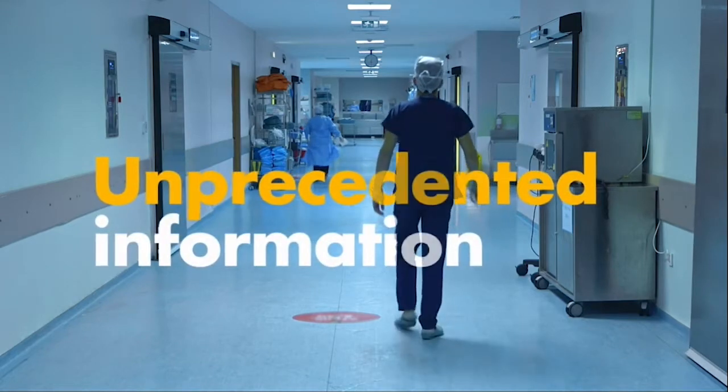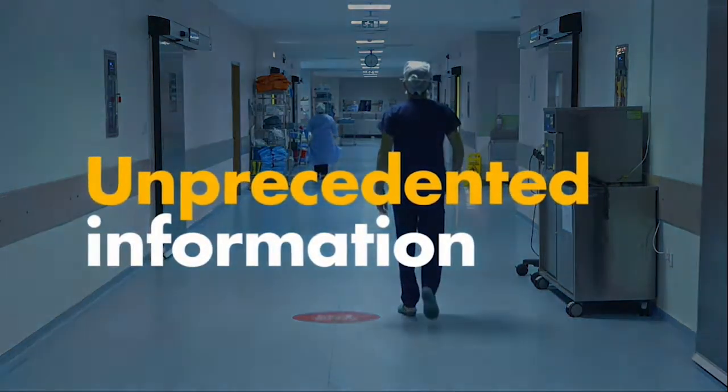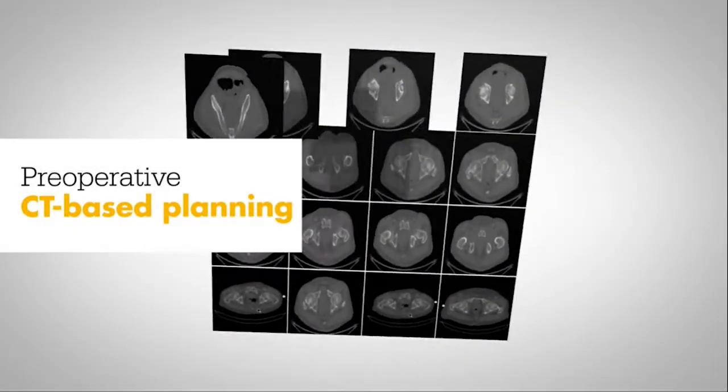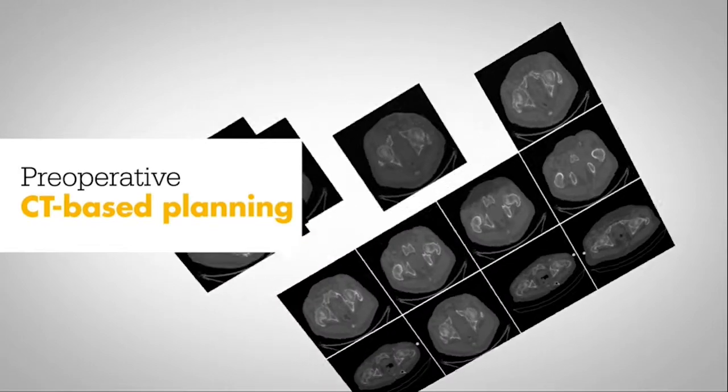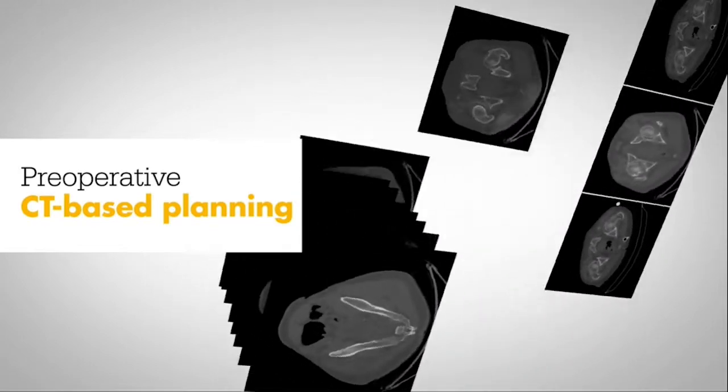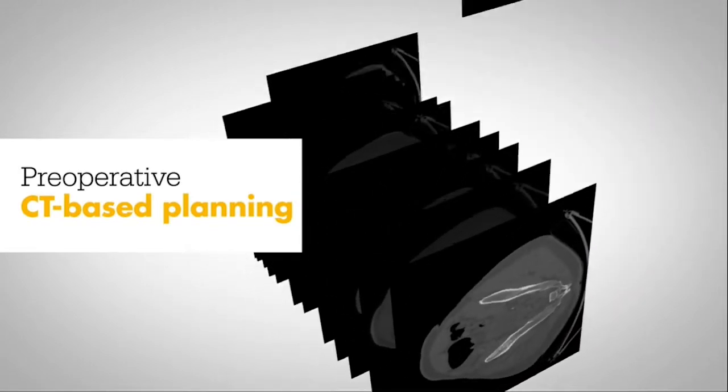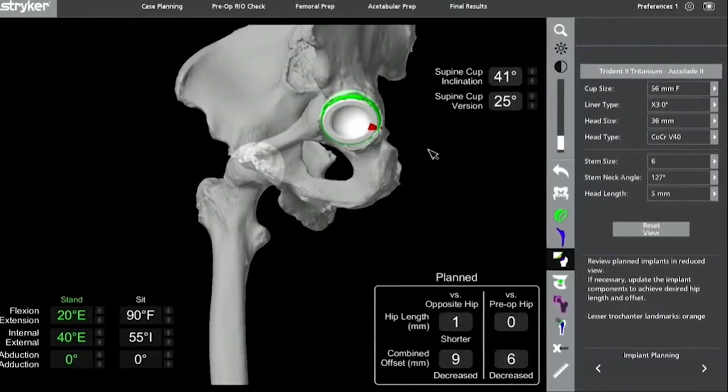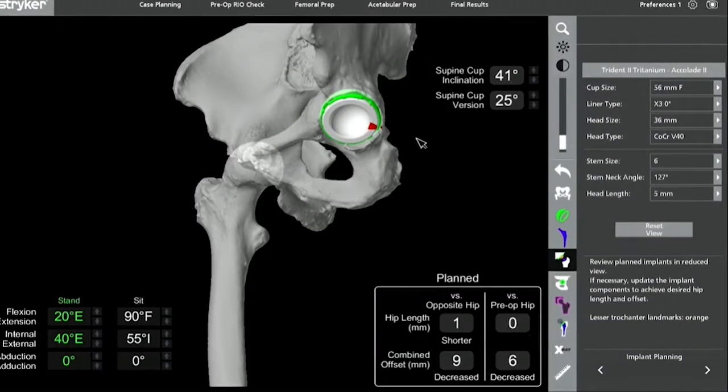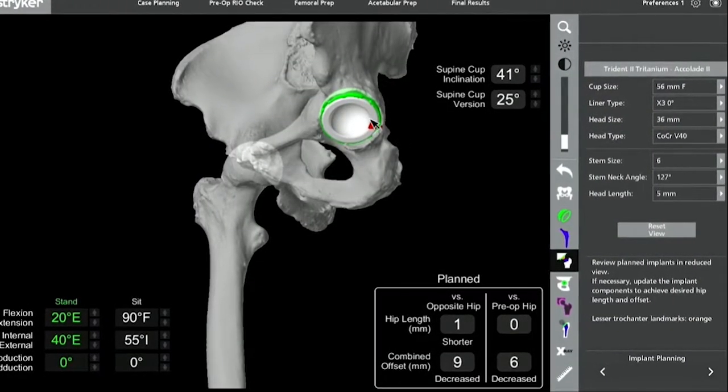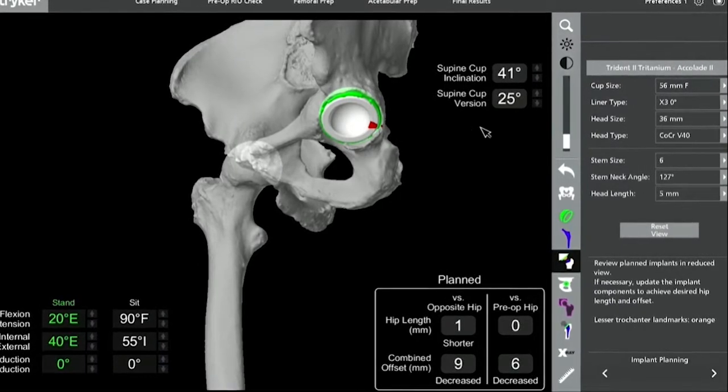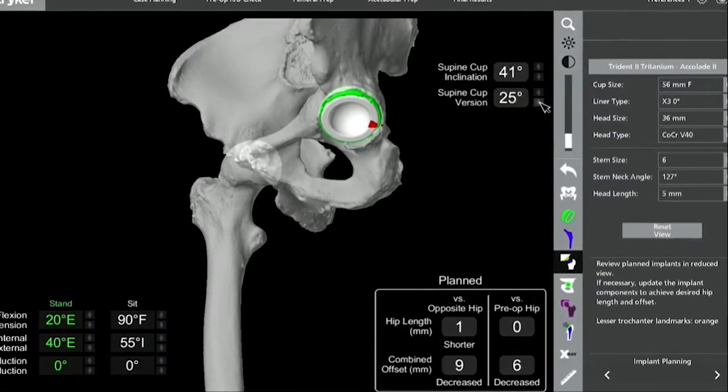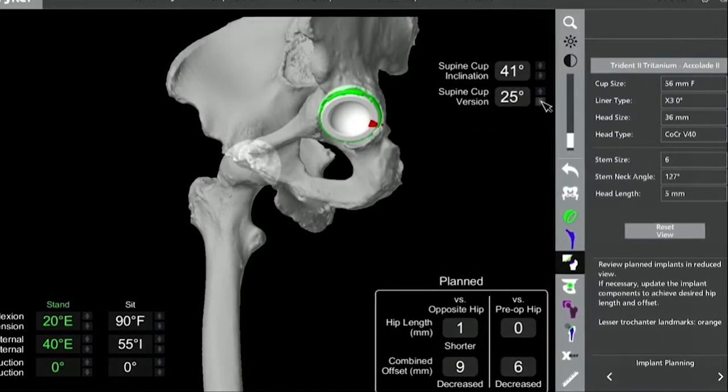Armed with unprecedented information, imagine a surgical plan built specifically for one patient. Imagine the ability to know of impingement issues before they arise.